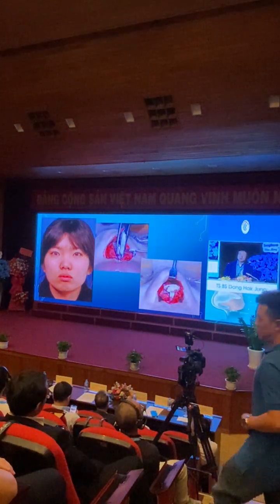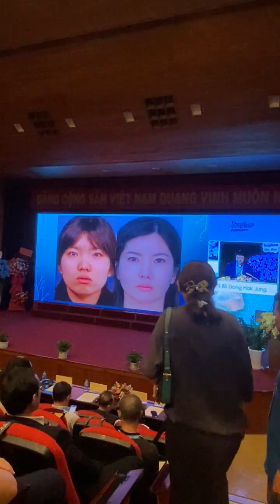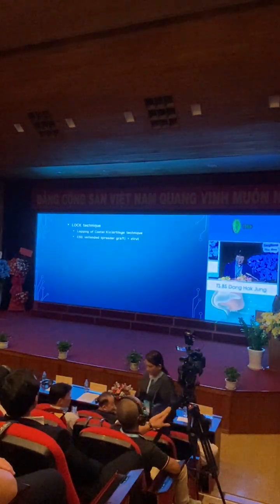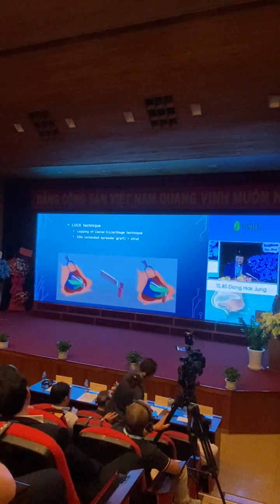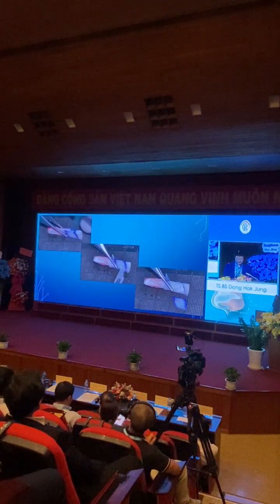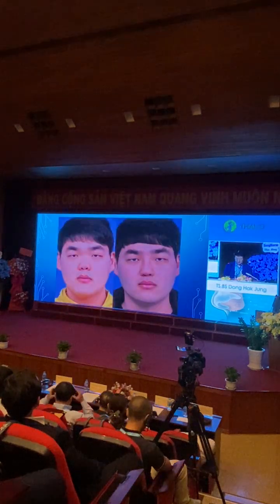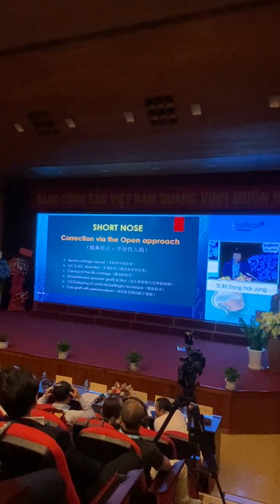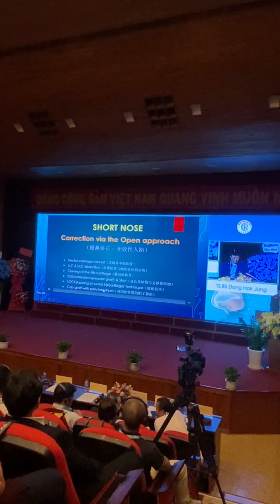And then it's the same. In case of a contracted nose, you have to give strong support. The lock technique is like this. It's my article. Cut, cut, and cut. Oh, it's too long.